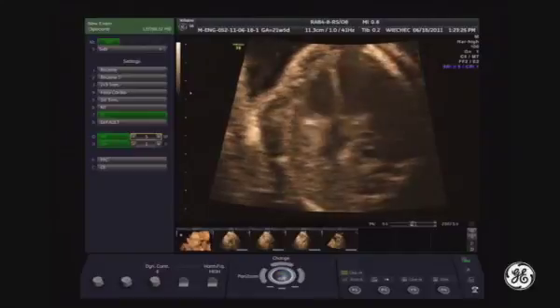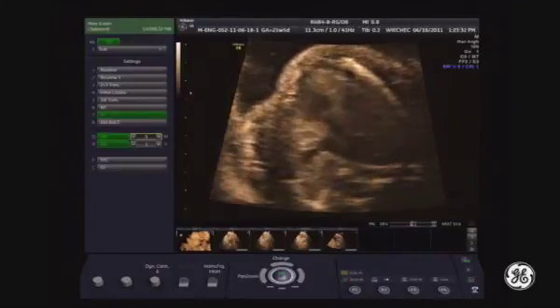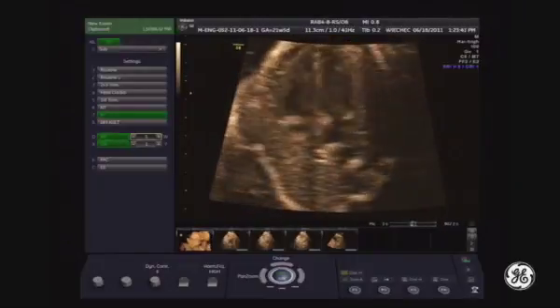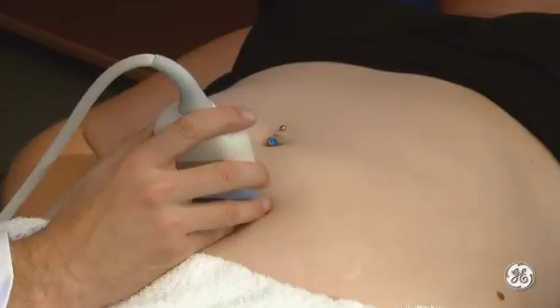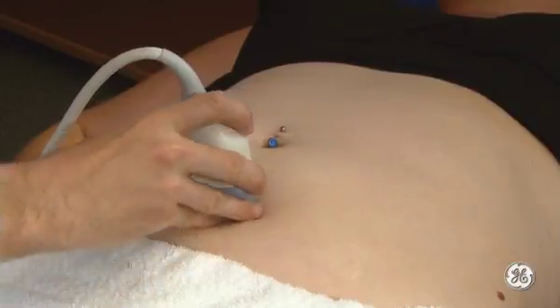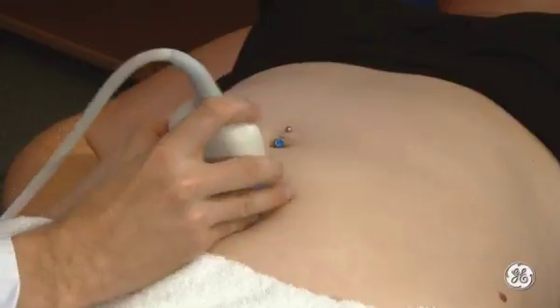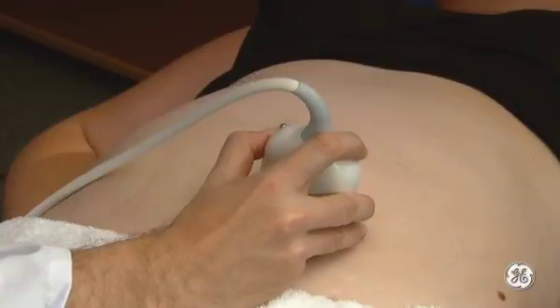Now, my imaging is based on a combination of the 3 most important image quality improving options: harmonics, speckle reduction, and cross-beam compounding. See that the tissue differentiation is much, much clearer in comparison with the native image that we had at the beginning. At this point, I need to emphasize once again how important is supported holding and moving of the transducer. You need support. When such advanced technology is used, operators should avoid fast and uncontrolled movements of the transducer, which can cause the imaging to be less clear.